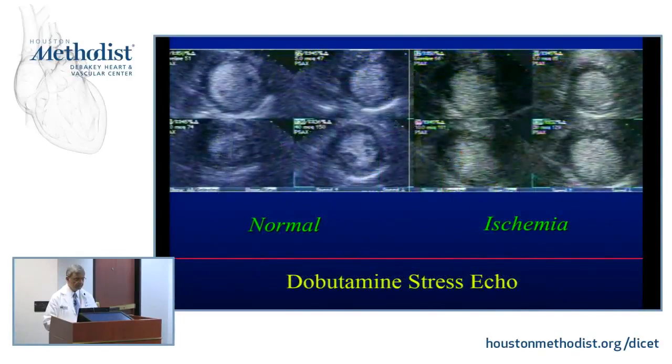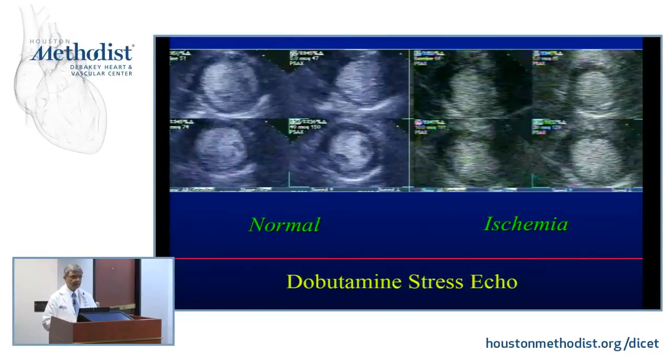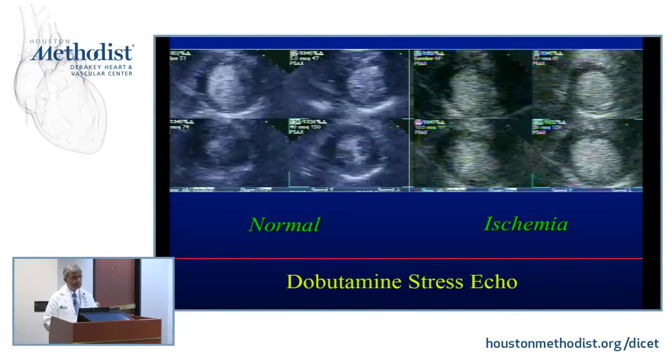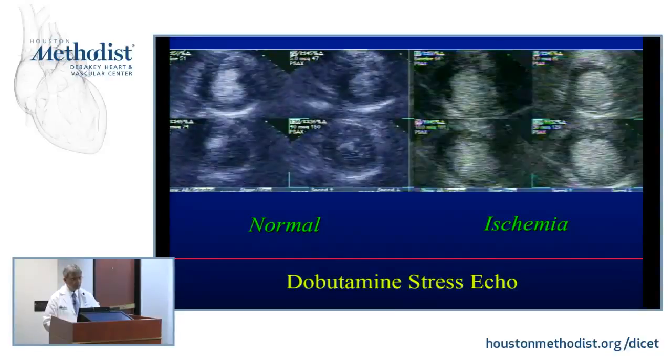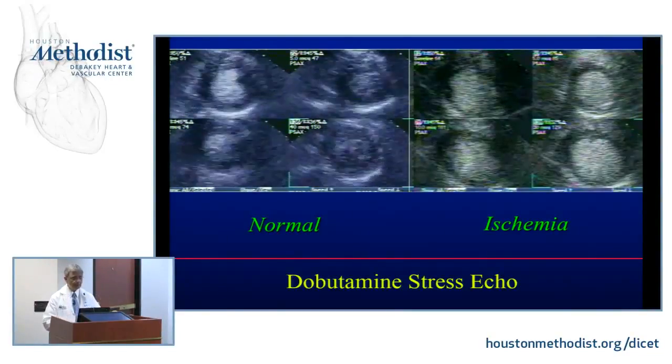So that's one. Two, yes, you could use it in stress echocardiography almost off-label, and I think most laboratories do. There are some laboratories who still don't use it at all. Some other laboratories use it 100% of the time, and the truth lies somewhere in between.